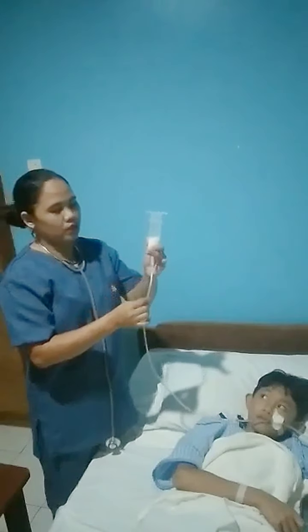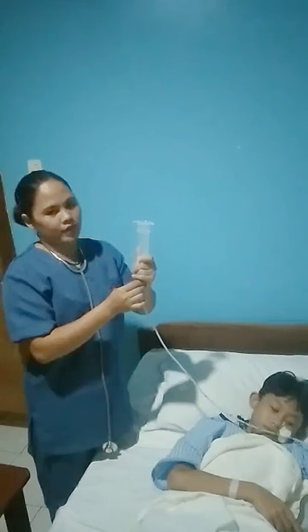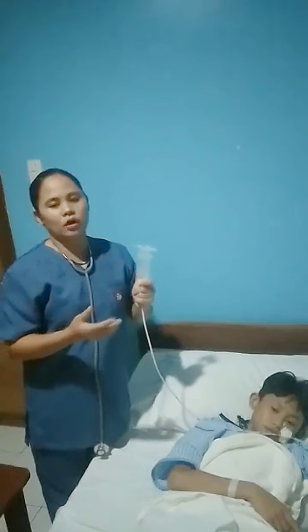Let go of the kink and let the gravity take the formula in the tube, and kink it back to avoid air from going in there. And then, between feedings, we also have to flush 10 ml of water to get rid of the blockage.